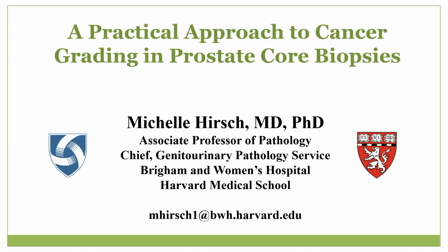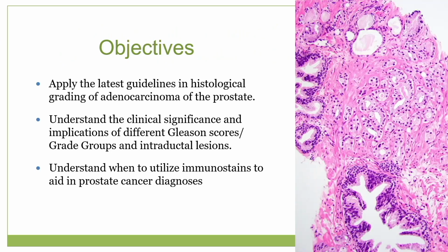So what I want to talk to you about today is prostate core biopsies, essentially grading of prostate cores. But although we're going to talk about details, what I really want to discuss and put forth to you is the practical approach, a common sense approach on how you approach your prostate cores. And of course, we'll get into that in more detail.